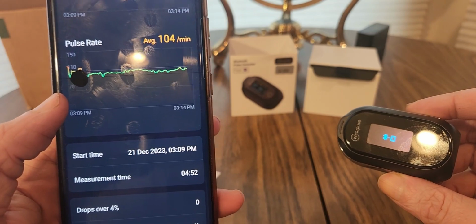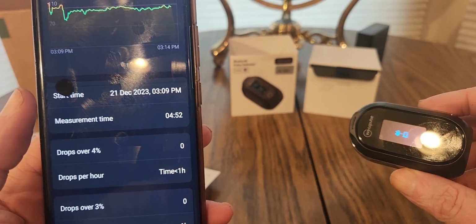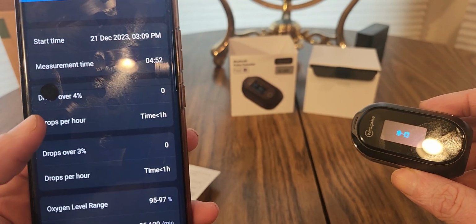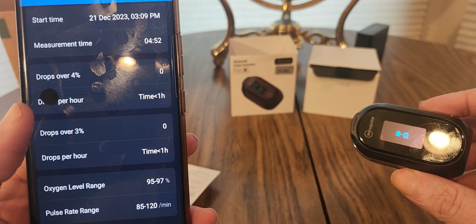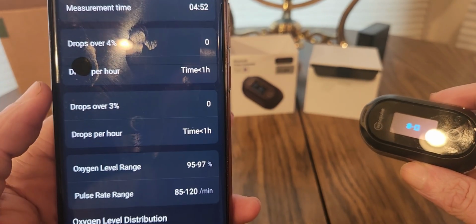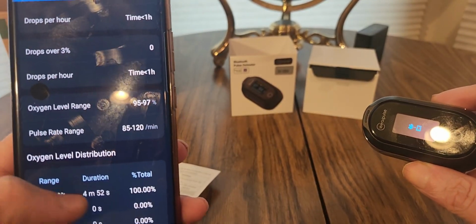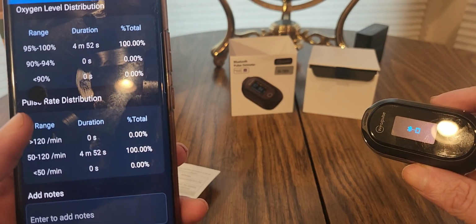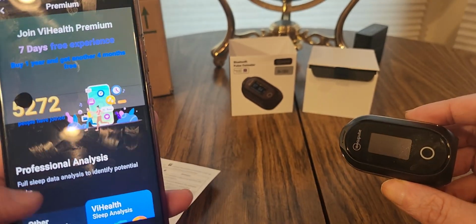So start time 309, measurement time 4 minutes 52 seconds, drops per hour. So I'm looking pretty good. Oxygen level is 95 to 97. Pulse rate is 85 to 120. I think that's right. And you can always add notes. So this is really cool, really helpful.